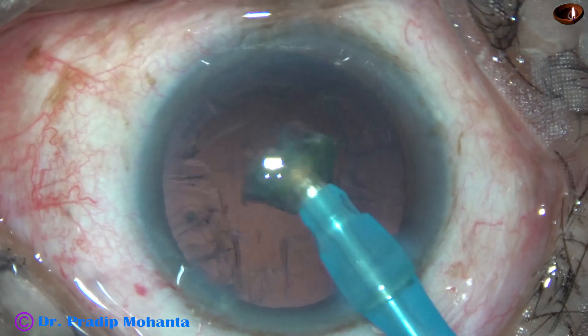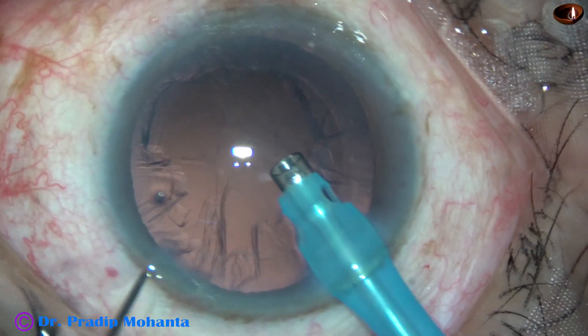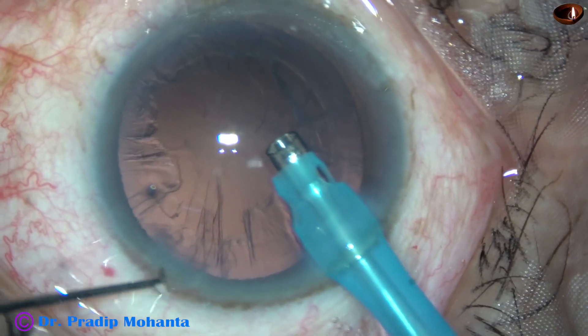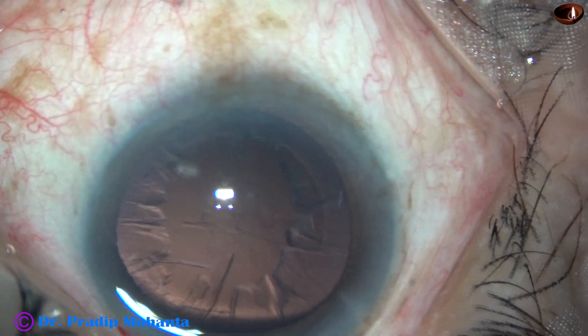So this is a very routine surgery. If the nucleus is of this consistency, we can hold it very easily and manage.